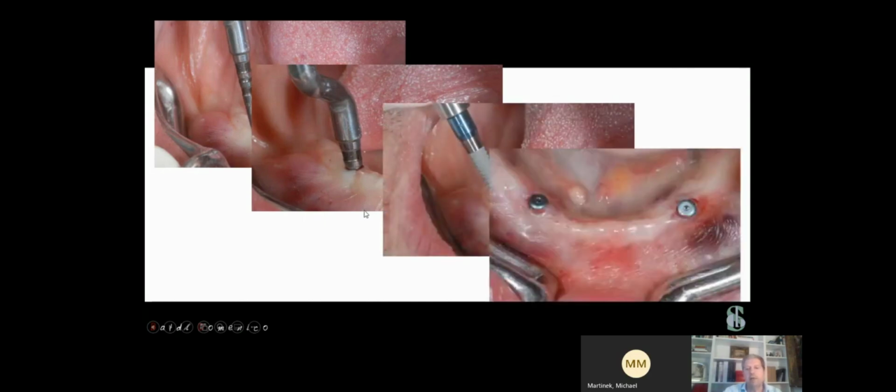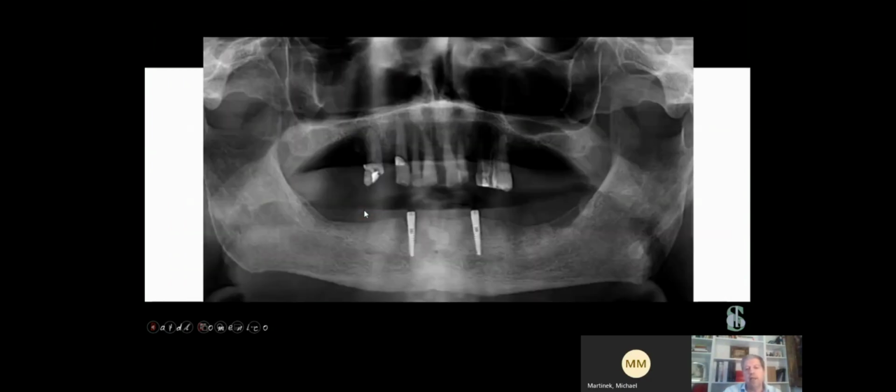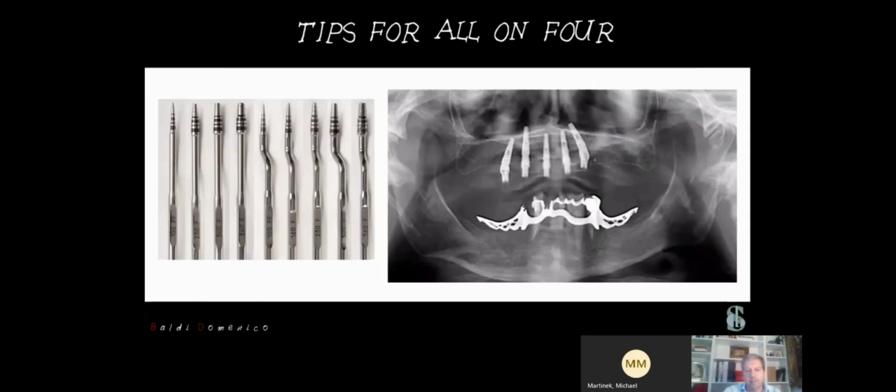So we can place our implant and the surgery is finished. So we can obtain this final situation. And we have this situation looking at the X-ray. Of course, we can also decide to make all on 4, all on 5, all on 6.